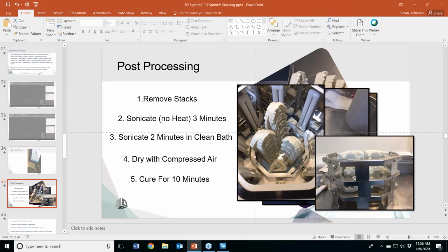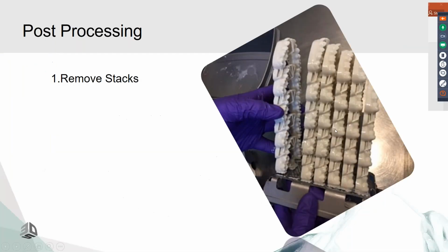All right, so the post-processing is exactly what I showed you. Here's a couple of examples here. So you're just going to remove the stacks. And by the way, on the PowerPoint, I'll be giving it to Holly, and she will disperse it to you. Nextdent and 3D Systems have made a great video on how to use this whole process as well. So I'm going to put a link to that.